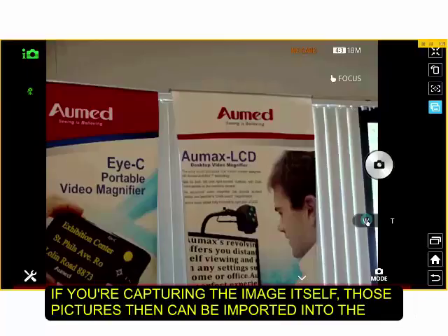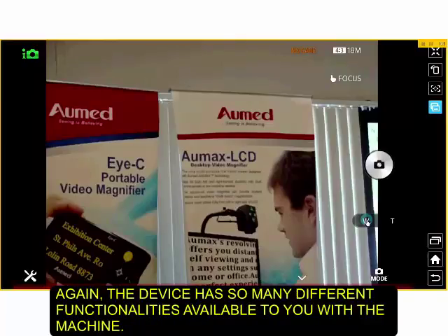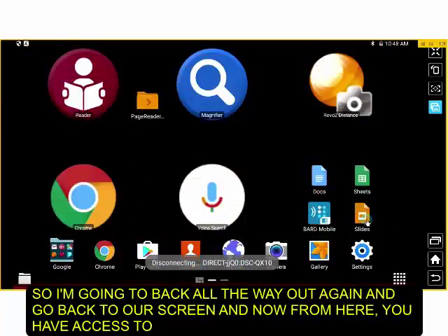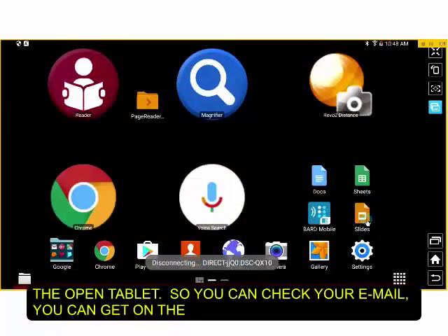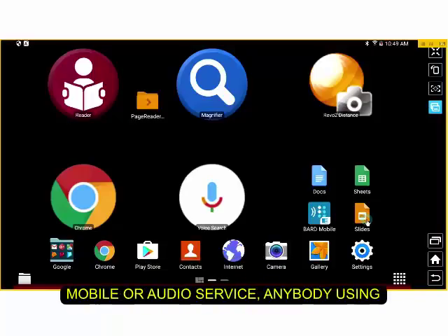If you're capturing the image itself, those pictures can then be imported into the page reader application or the OCR application, and you can have those read to you as well. So again, there's just so much different functionality that's available to you with the machine. So I'm going to back all the way out now, go back to our screen. And now from here, you have access to the open tablet. So you can check your email, you can get on the internet, any application like Bard Mobile or Audible for book service, you can do that.